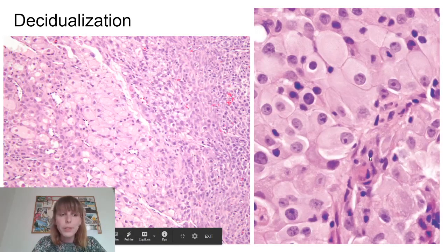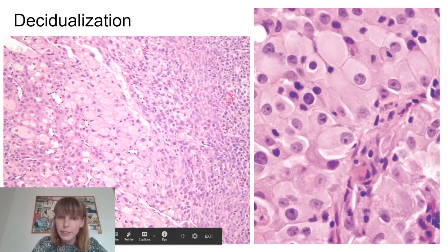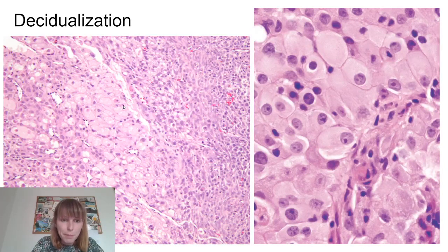What we will see on the virtual slides in a while will be the decidual cells under the microscope. If you remember from the last time, from the uterus slide, we just saw something like this on the right between the uterine glands. So it's sort of loose connective tissue, lots of cells, blood vessels, nothing really out of the ordinary. And this part here is a part of the endometrium that's undergoing the decidualization process.